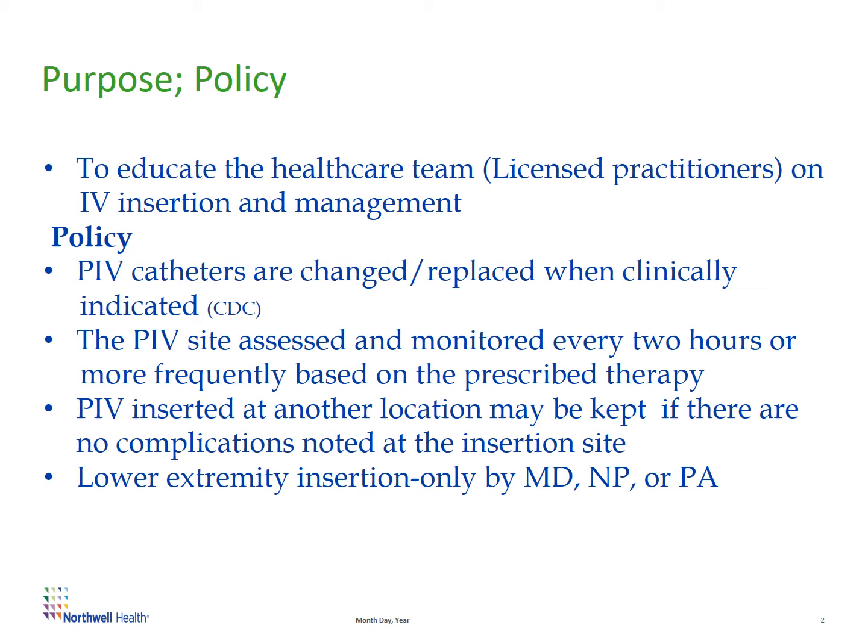The PIV inserted at another location, which means the patient is coming from outside, and if it is inserted by another facility, healthcare workers or the EMTs, you can keep it if there are no complications noted at the insertion site and the equipment used are according to your institution's policy.